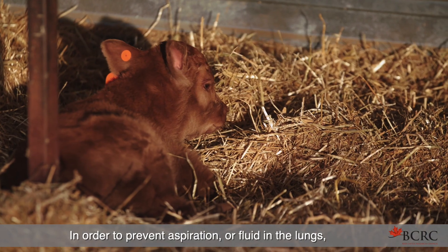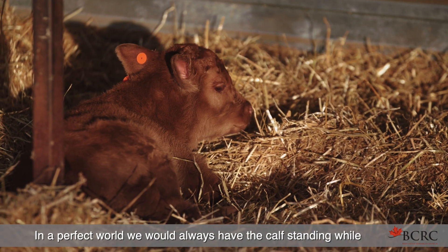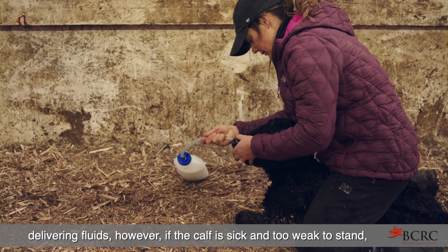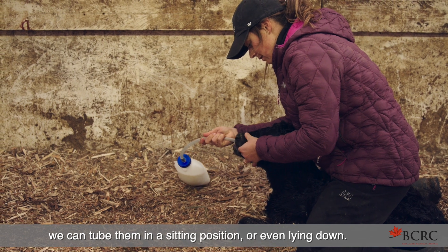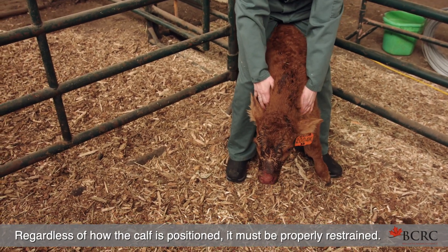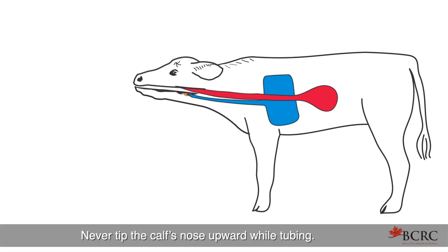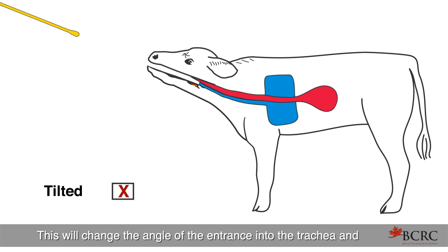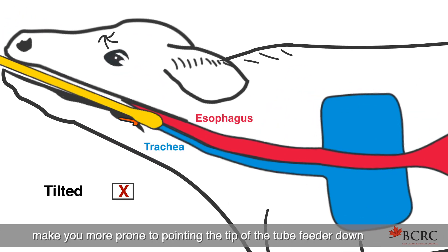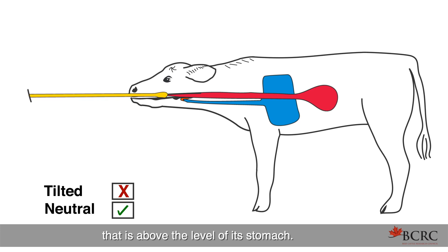To prevent aspiration or fluid in the lungs, we need to ensure the calf is in the proper position. In a perfect world we would always have the calf standing while delivering fluids. However, if the calf is sick and too weak to stand, we can tube them in a sitting position or even lying down. Regardless of how the calf is positioned, it must be properly restrained. If standing, back the calf into a corner for better head control. Never tip the calf's nose upward while tubing, as this changes the angle of the entrance into the trachea and makes you more prone to entering it. Leave the calf's head in a neutral position that is above the level of its stomach.